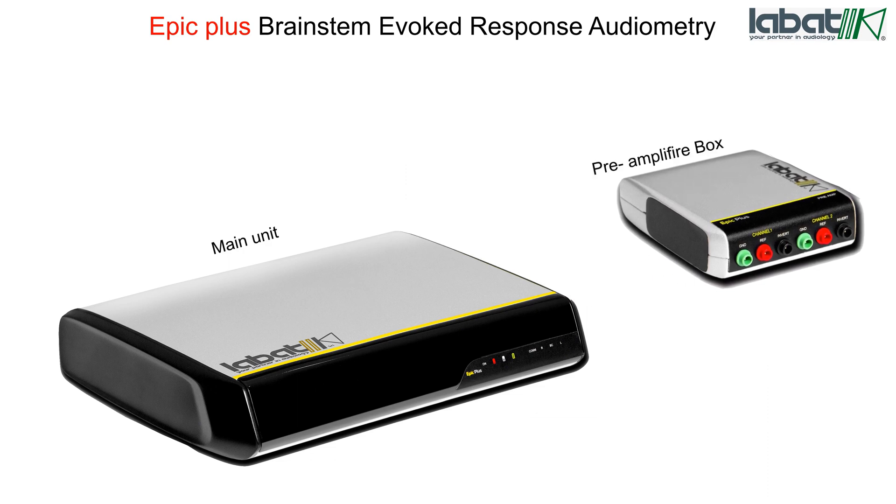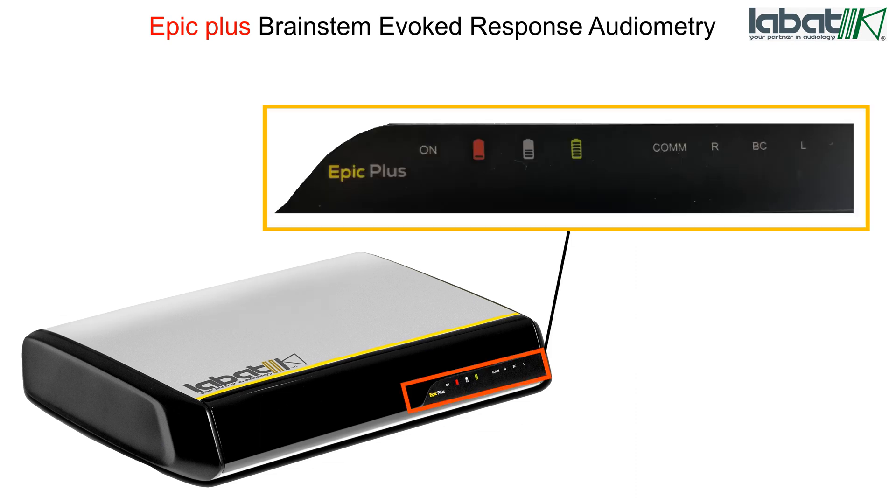Both units are connected with the help of a pre-amplifier cable. On the main unit, there are power-on indication and battery status indicators: 25% battery status indicator, 50% battery status indicator, and 100% battery status indicator. There is also a COM indication for communication of the device with software, and R and L indications.